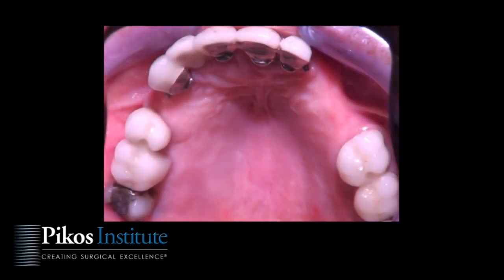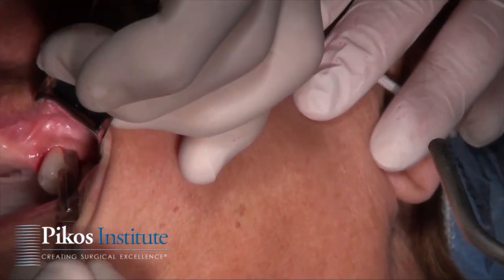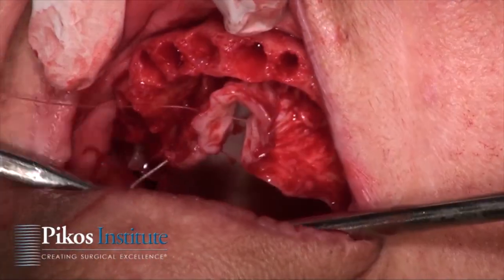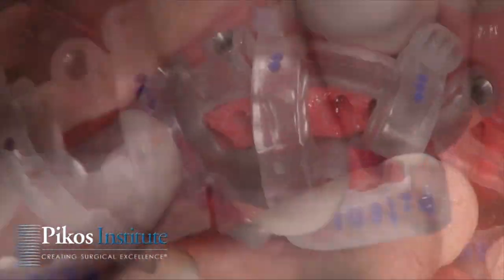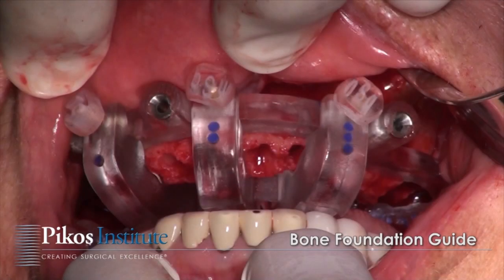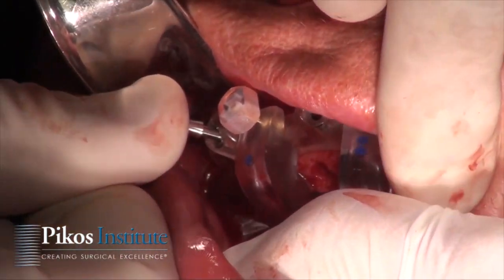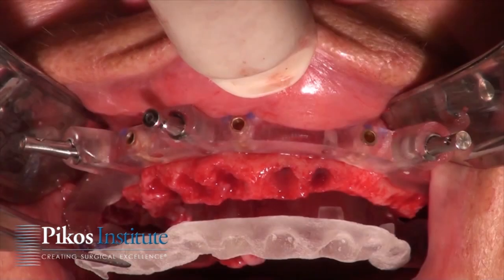This is a patient in her late 50s who came to us with what we call terminal dentition, meaning just some remaining maxillary teeth that really are not in good repair. As you're seeing here, we're addressing the maxillary arch, full flap reflection. We've edentulated the arch. We're placing what's termed a bone foundation guide, which is part of the protocol that we have followed. This is indexed into the opposing arch. And now at that point, we're able to drill our appropriate holes for pin fixation. We remove the struts from this foundation guide.